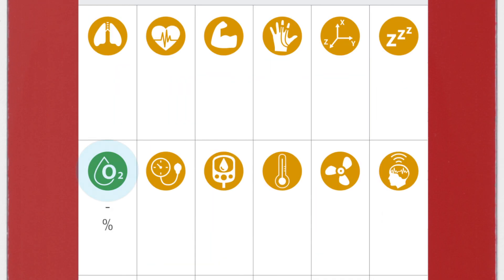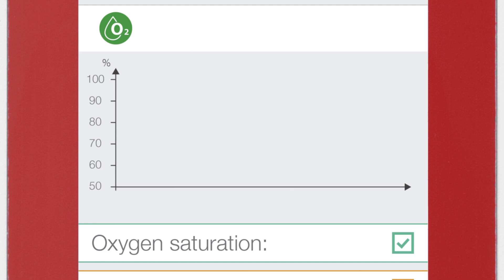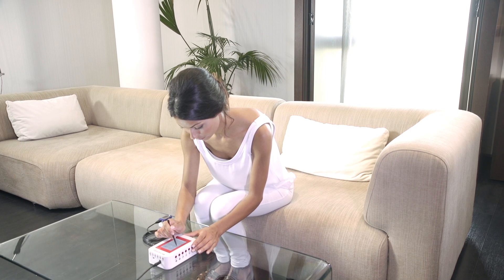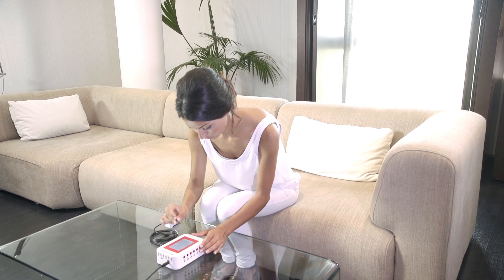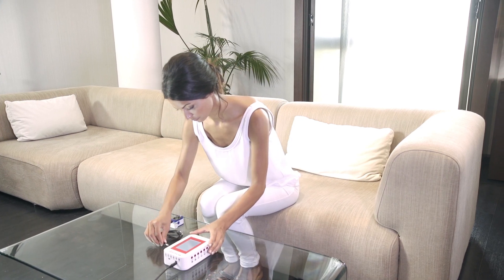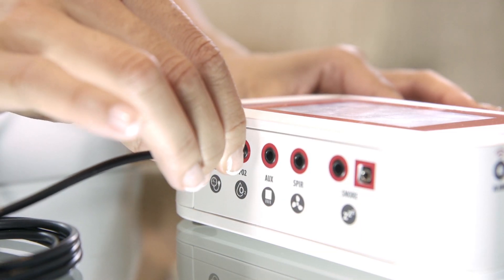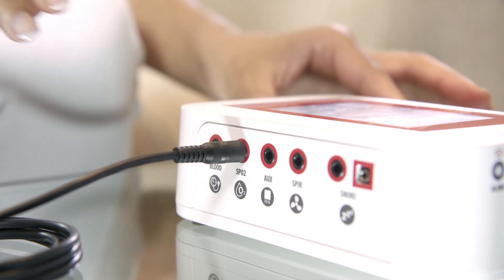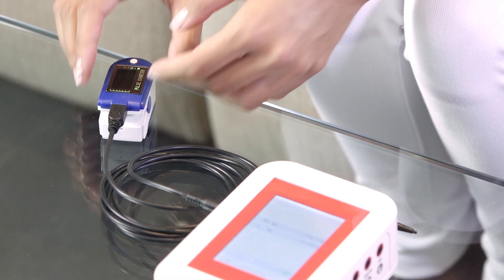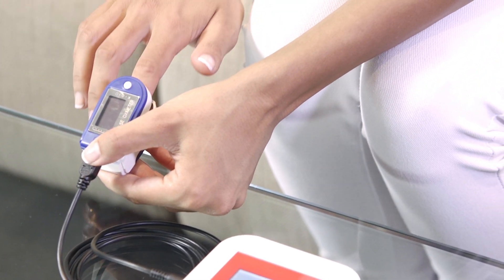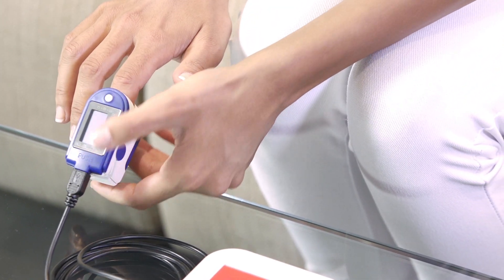Click on the sensor icon to start real-time data visualization. Plug in the mini USB connector in the SPO2 sensor and the jack connector in the MySignals device. Place the sensor on your finger and press the on button.